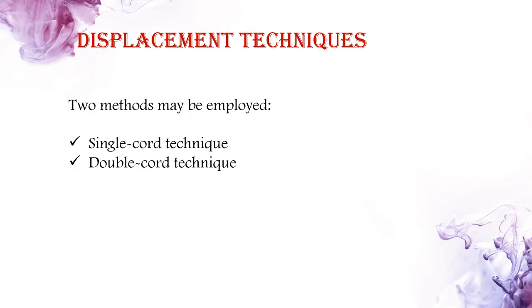Displacement techniques. Two methods may be employed: single cord technique and double cord technique. Single cord technique, one cord is placed in the sulcus and the impression is made immediately following retraction after removing the cord. Double cord technique, two cords are used.